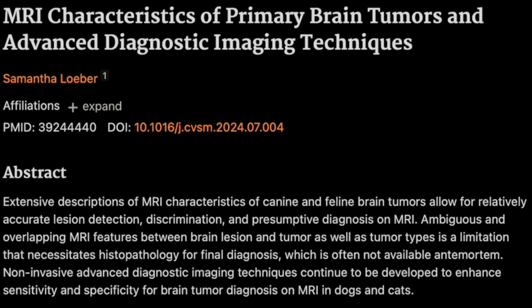What about gliomas? What do their fingerprints look like? Gliomas, they're tricky. Their signal intensity on those T1 and T2 images can be all over the place. This is not as clear cut. Nope. They can be isointense, hypointense, or hyperintense. Oh, so they're like, guess what? Could be anything. Pretty much. Keeps us on our toes. So we've got to take all those clues together: location, borders, that signal intensity, and then, of course, the contrast enhancement we talked about. Right, the glow up.